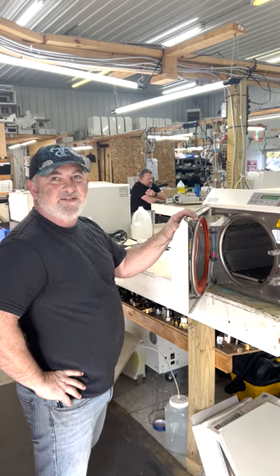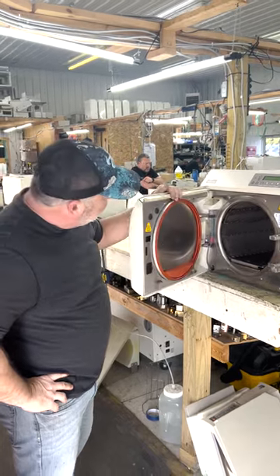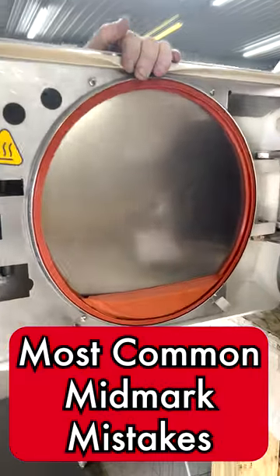Hi, this is Ron with Sterilizer with AutoClave Solutions. We've got an M11 new style here, and I'm going to talk about some of the most common mistakes I find.